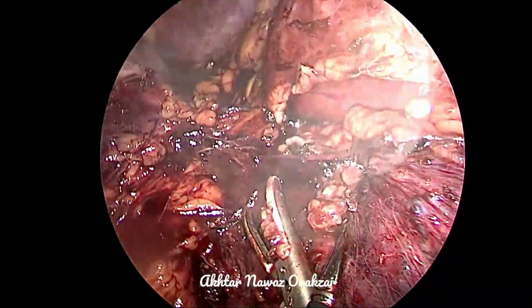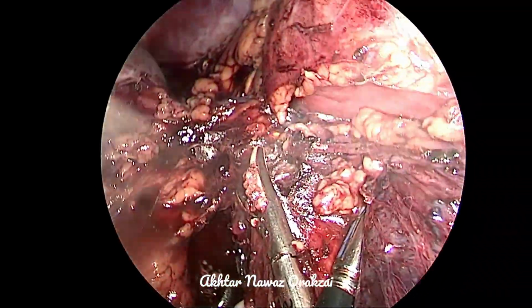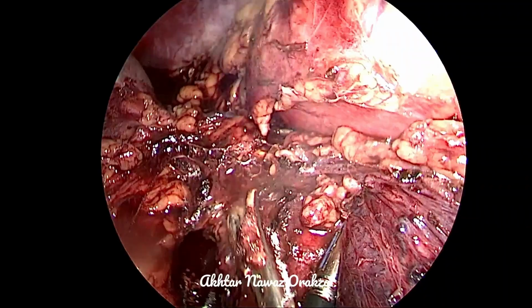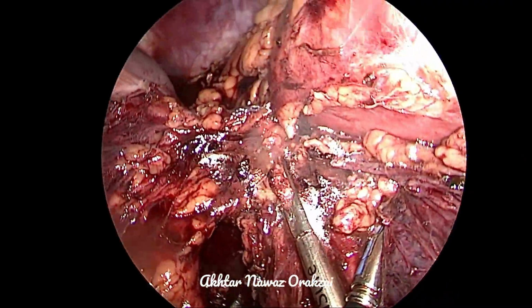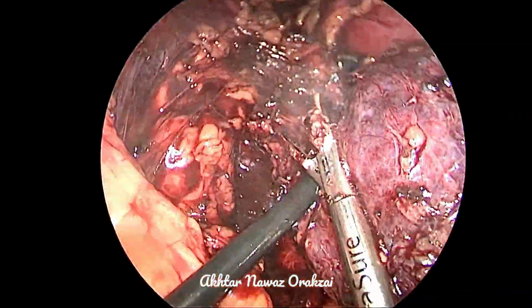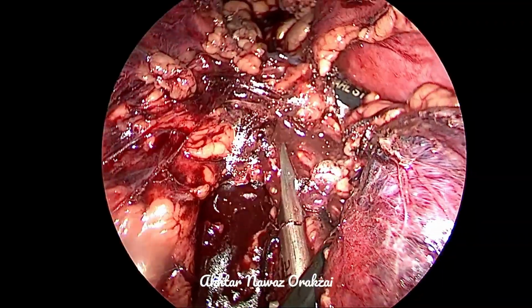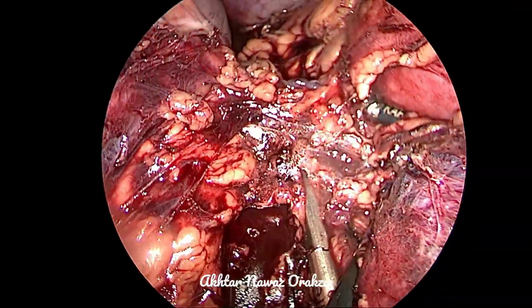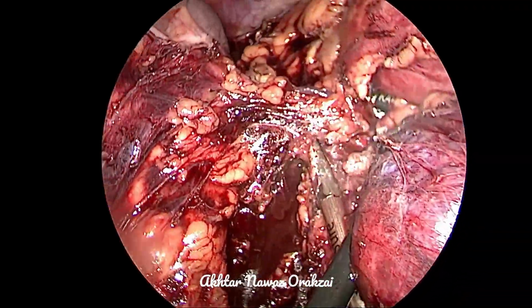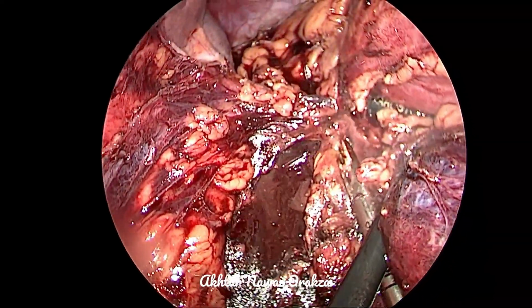We expect to encounter inferior phrenic artery. However, using the ligashore can coagulate up to a vessel of up to 7 millimeter diameter. This is the normal portion of the adrenal gland, you can see. So that might be coagulated by the ligashore.